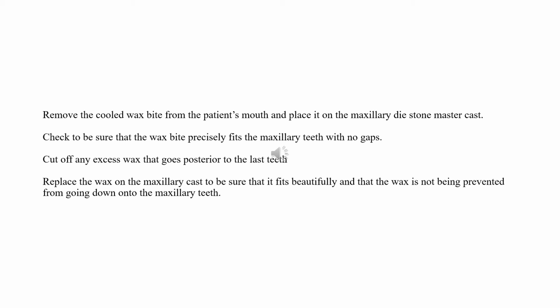And then a lot of times there's extra wax going past the back teeth, and that extra wax could push on the stone and prevent you from biting all the way down into the cast, prevent the cast from seating all the way. So cut off all the excess wax that goes posterior to the last teeth. You don't need it. You're mounting these using the teeth. And then replace the wax on the maxillary cast and reevaluate to see if everything's fitting beautifully.